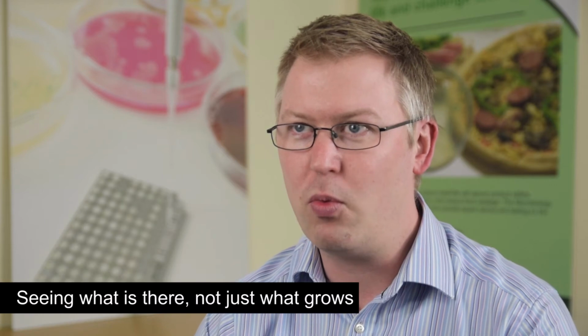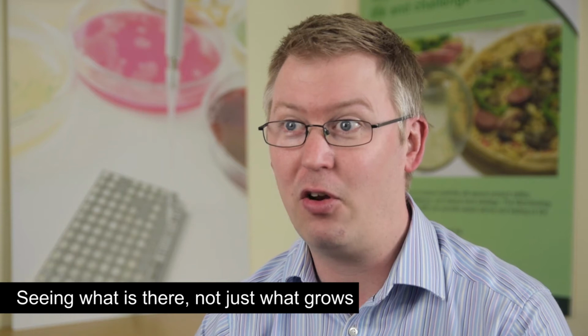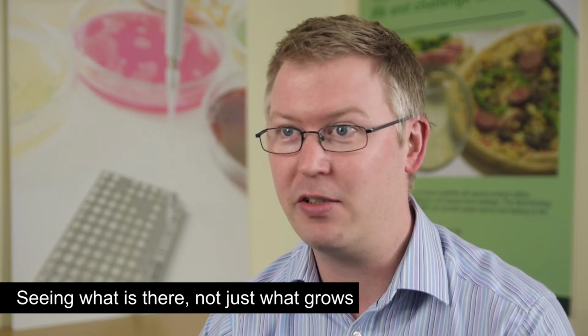In the food and drink industry, microbiology has always traditionally relied on culture. So we have been able to come up with figures of, we have about 1 million colony forming units of a particular organism per gram of this product. AMP is a different way of looking at the microflora of a product.